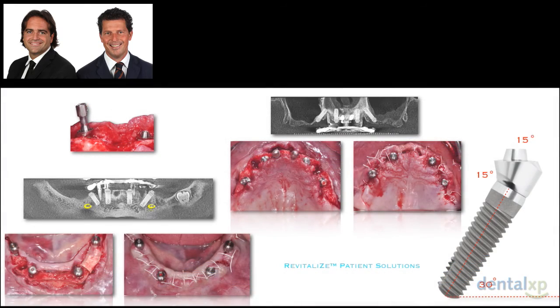Those are some pictures of the surgical plan, and you can see how important all the prosthetic components are in this kind of rehabilitation solution. We have multi-unit angled abutments that are helping us, prosthetically speaking, in compensating the angulation, the tilting of the most distal implant. You can see the before and after.